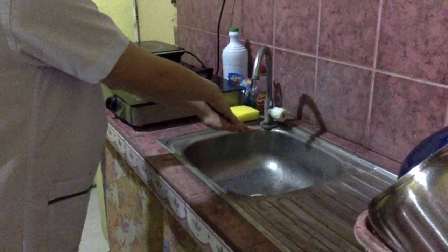First, perform hand hygiene. Hand hygiene is always done prior to any procedure or patient interaction. It prevents the transmission of the microorganisms which can lead to infection or complications that can be detrimental to the patient's health. The next step is to prepare all the materials or equipment needed. So it is very important to prepare all the materials beforehand to ensure that everything is readily available so that there will be no delays and there will be a smooth and easy flow of the procedure.